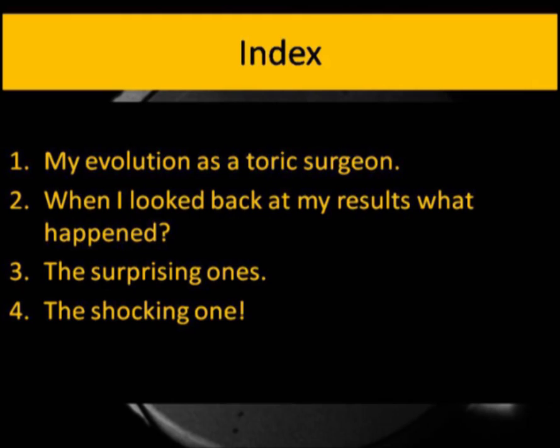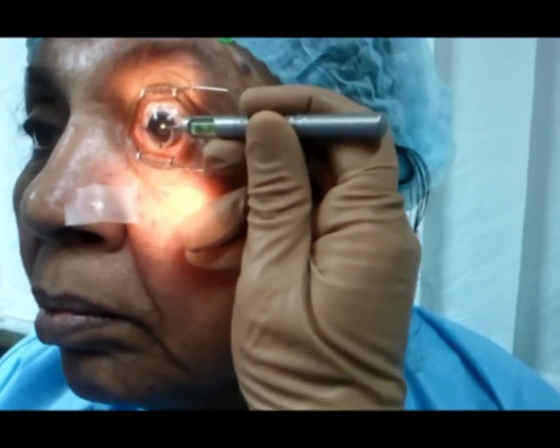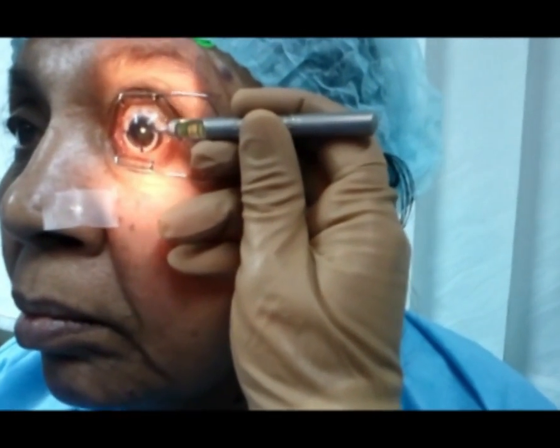When I look back at my results, what happened? The results, the surprising ones and the shocking one. They're all there in the story. Every toric story begins with this, and mine was no different, the markings. I began with the highly recommended bubble marker.